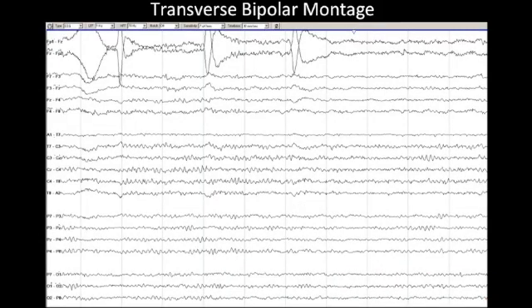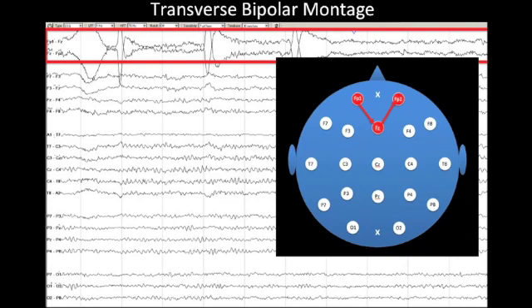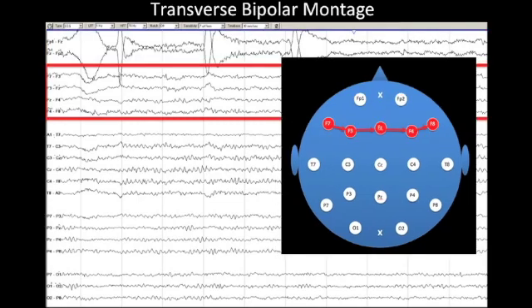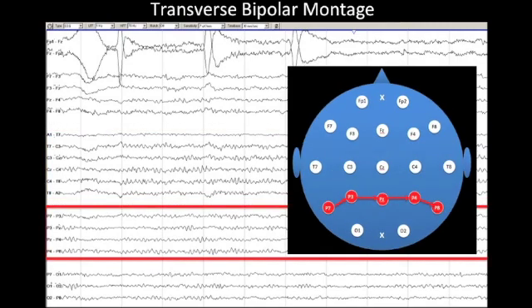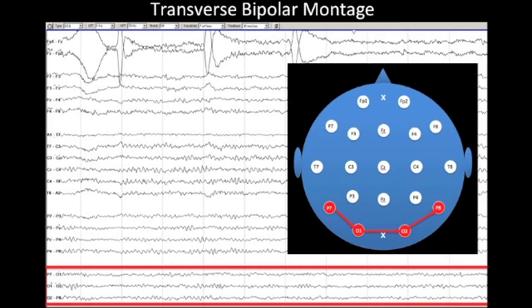Another type of bipolar montage is the transverse bipolar montage, arranged as if we are looking at the top of the head with the patient facing upward. First, we have a short chain over the forehead, then a longer chain extending from left to right over the front of the head, then a very long chain extending from ear to ear, then a parietal chain, and finally a short parietal-occipital chain. The transverse bipolar montage is particularly good at focusing attention on the center of the head, and since many sleep transients are maximal there, it can be useful for looking at sleep.